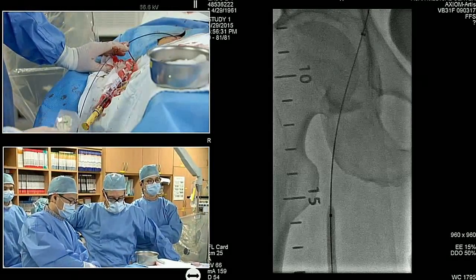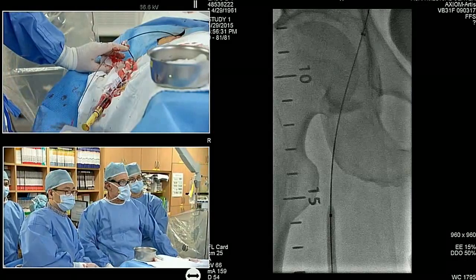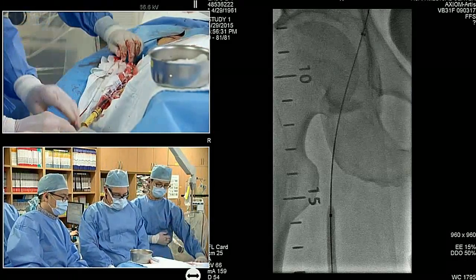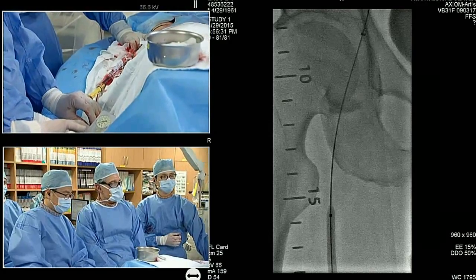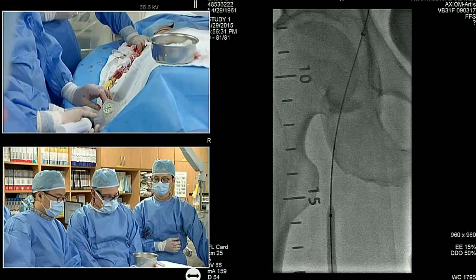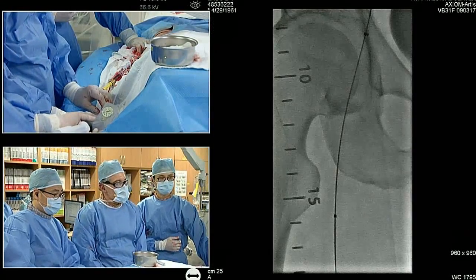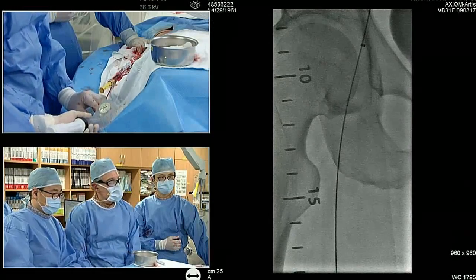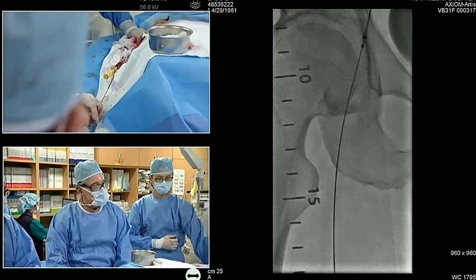Okay, down, that's a minute 30. So I think in the interest of time, what we'll do is take a picture, because we know we have to stent the origin for sure. The question is whether anything else is needed for the DCB treatment segments. Yes, please. As I see, there's only about 8-9 minutes remaining.